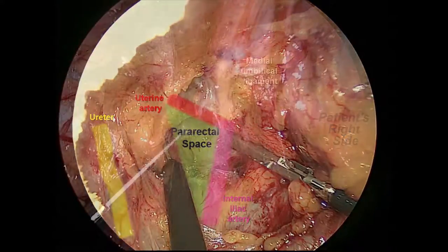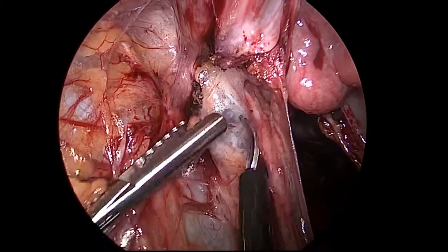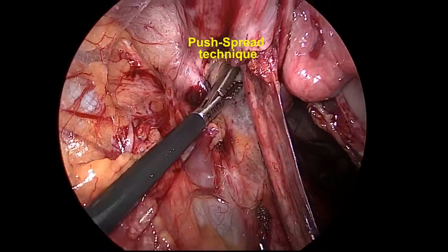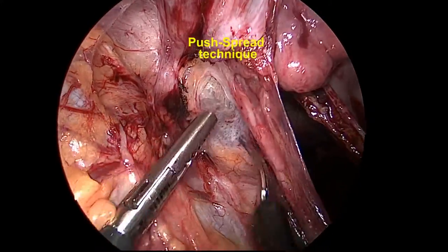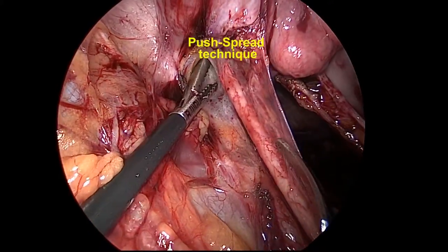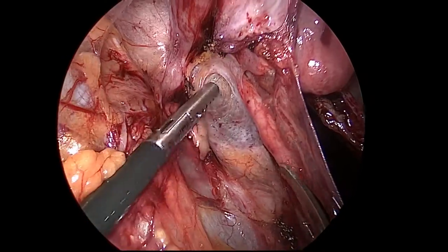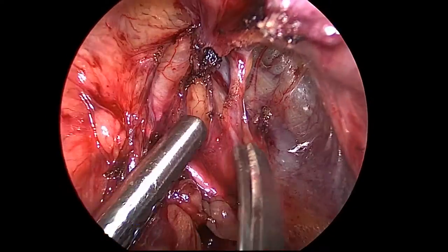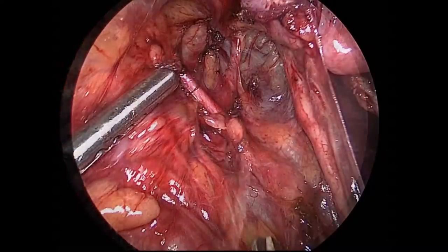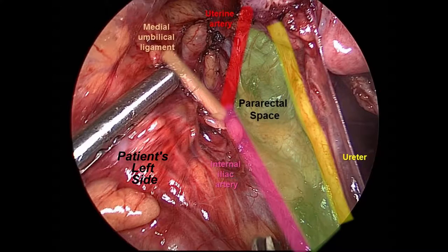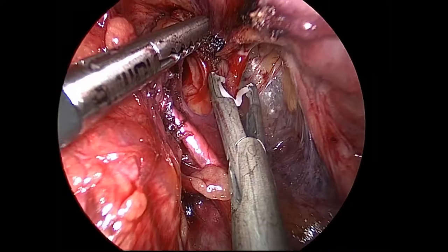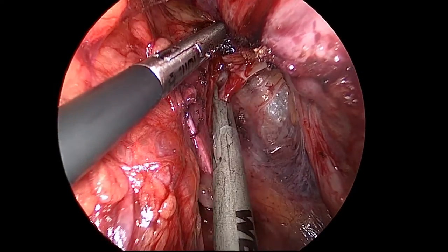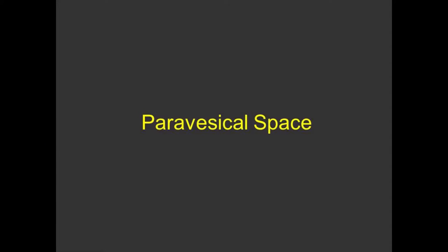The pararectal space is opened and the ureter is isolated by using a push-spread technique in combination with a sweeping maneuver parallel to the course of the ureter. The classic water-under-the-bridge relationship between the uterine artery and the ureter may be exploited to locate and safely ligate the uterine artery at its origin from the internal iliac artery.